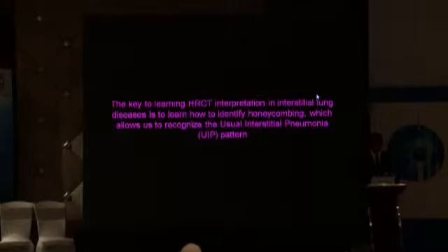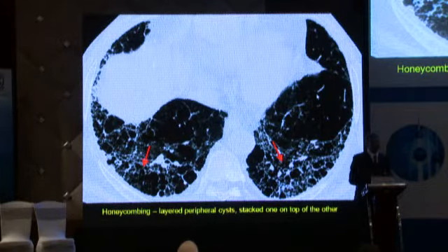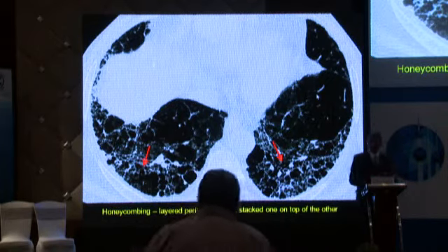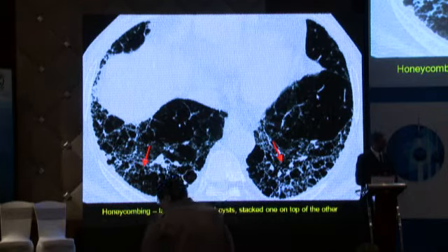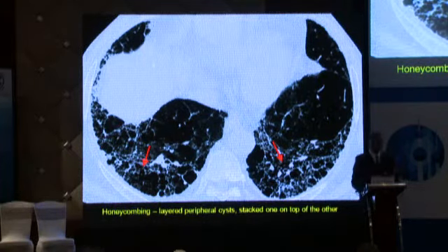One of the commonest conditions, as I said, is idiopathic pulmonary fibrosis. It's pretty much a deadly condition with a 5-year survival rate of 20%, and it's worse than having stage 1A lung cancer or an early form of breast cancer. The way to diagnose IPF is to be able to pick up honeycombing.